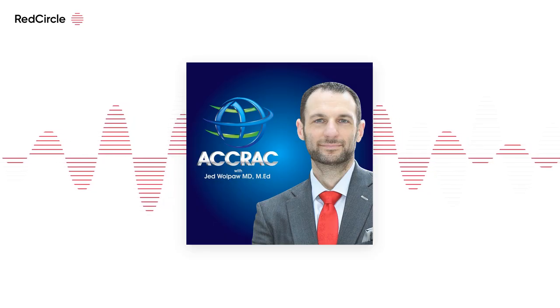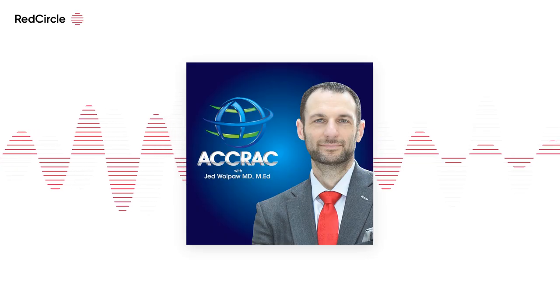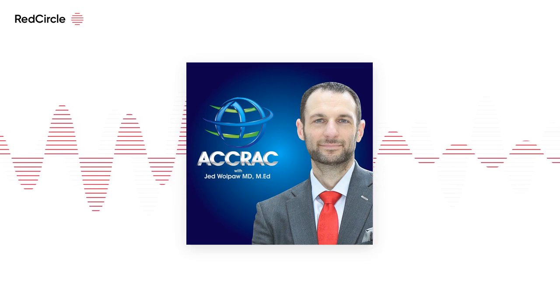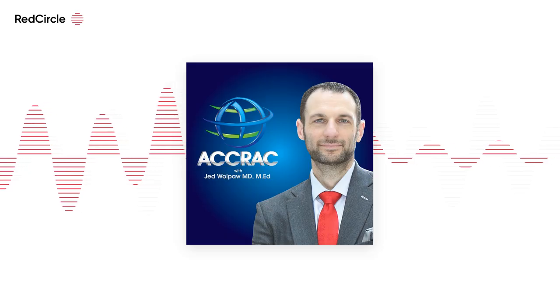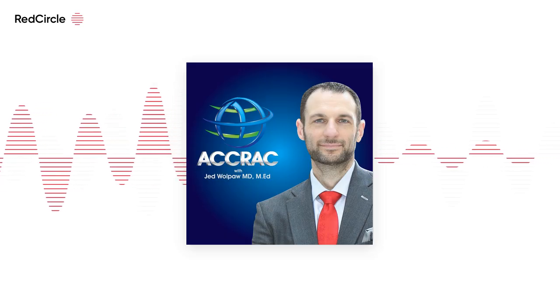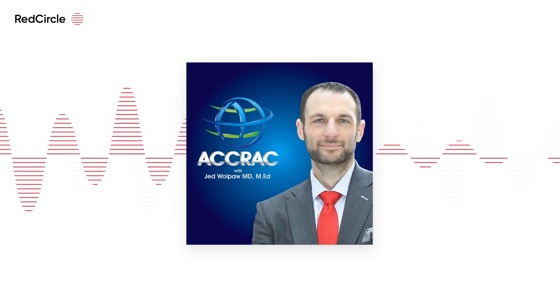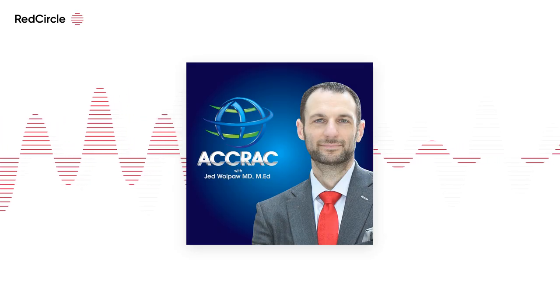Yeah. So you've mentioned EIT a lot. Let's talk about that. What is EIT and what does it help us do? Sure. EIT: E, electrical, I, impedance, T, tomography. So essentially it sends a small electrical current. It's so small it's not felt by the patient. It's like 7 to 9 milliamps. It's a very small electrical current.